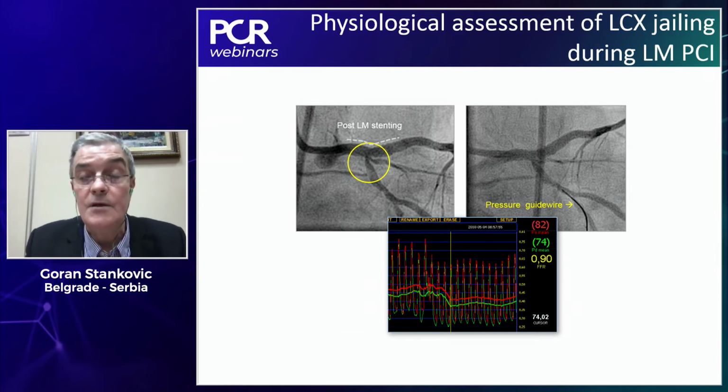But in addition, if I can be practical, from the studies in provisional, kissing balloon inflation does not improve clinical outcome, but there is no penalty for performing final kissing. So if I have doubt and I have a large vessel like left main, I would rather proceed with kissing, remove the metal, and position the carina in the center with simultaneous inflation of two balloons in case of doubt.